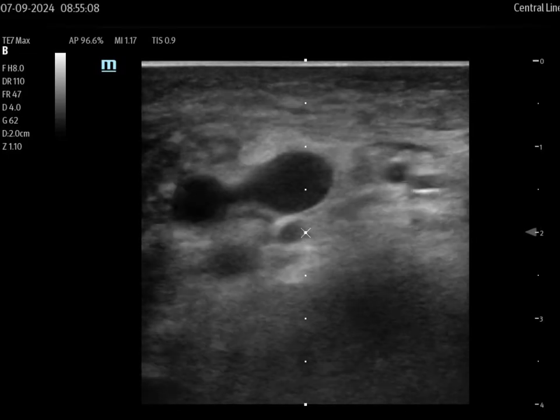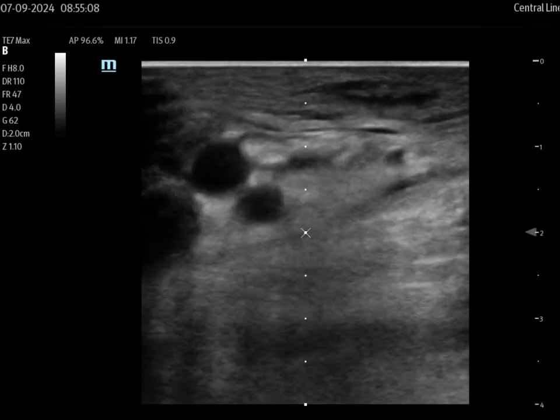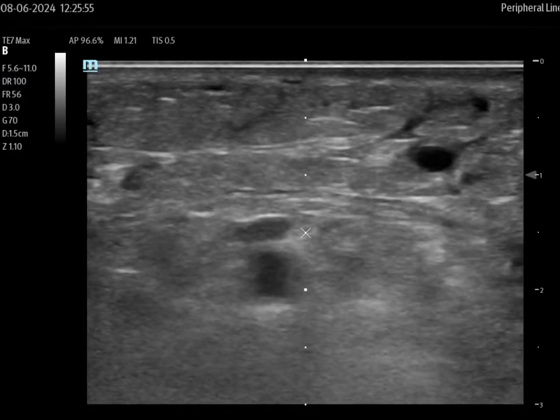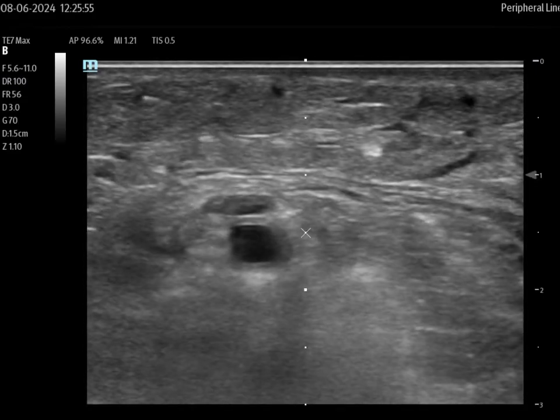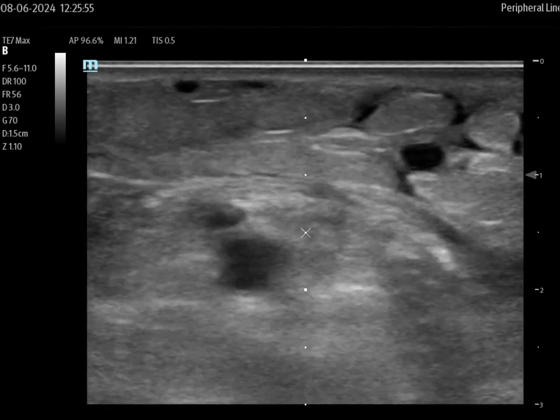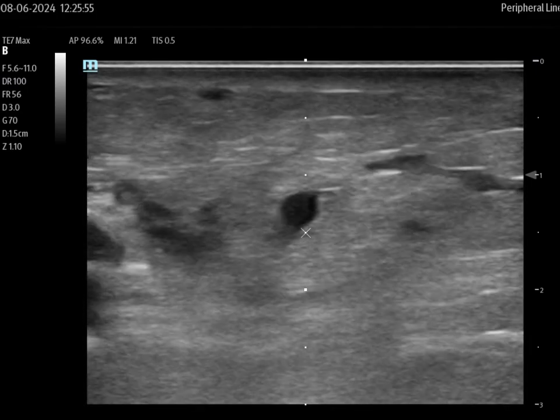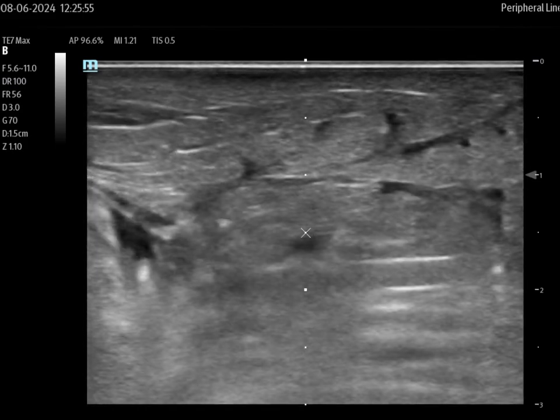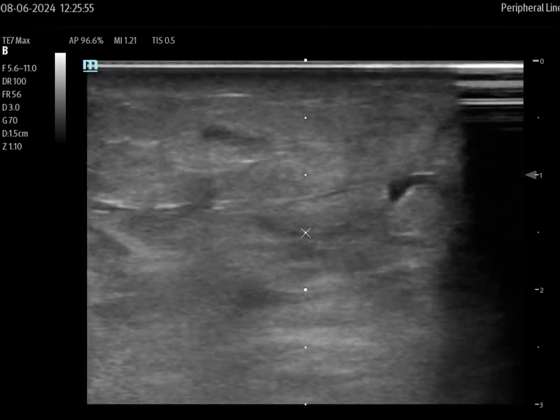Hello, and thanks for tuning in. In this video, I'm going to show you how to identify a blood clot or thrombus in a peripheral extremity using ultrasound. This is an important skill to understand because there has been a significant rise in superficial venous thrombosis, that's SVT, or deep vein thrombosis, DVT, found in the in-hospital patient population.